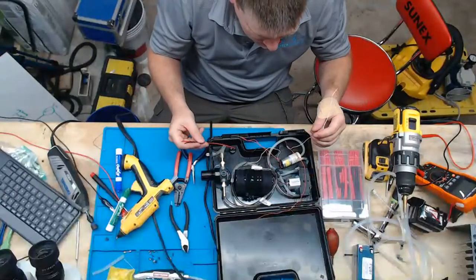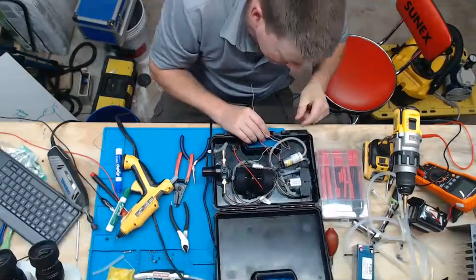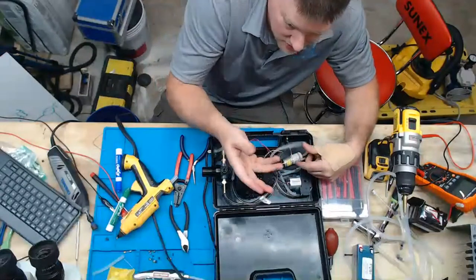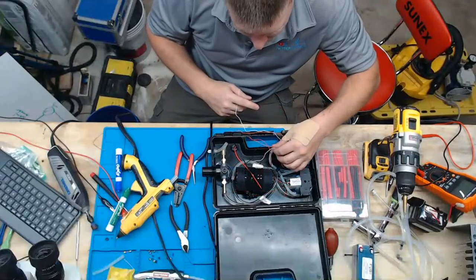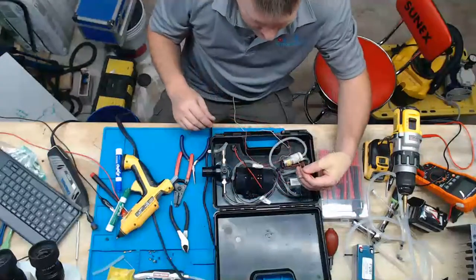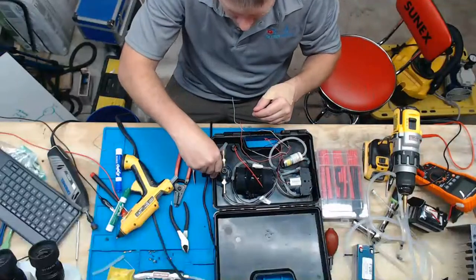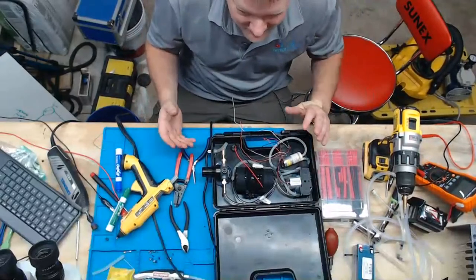I have my power switch installed. I just got through installing a DC power jack, like a barrel jack you see on most medical devices. So that's the guy that's sitting right here. I've got both my motors hooked up in parallel. And I was just going to start soldering this stuff and putting it together, and finishing it up and showing you guys what this stupid thing can really do, because it's pretty crazy.